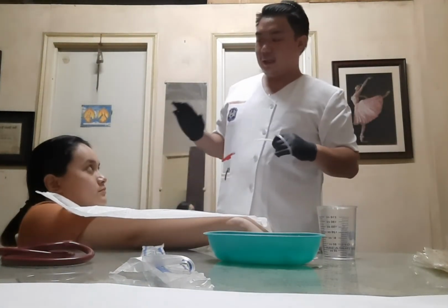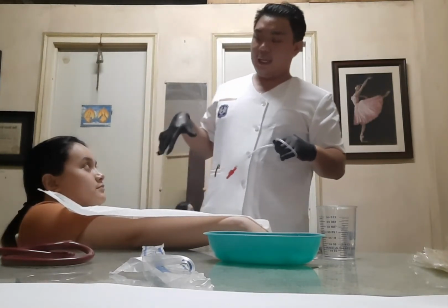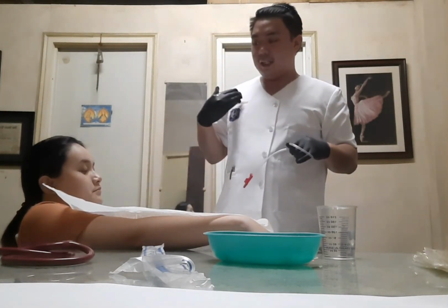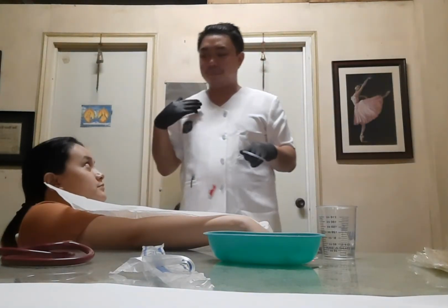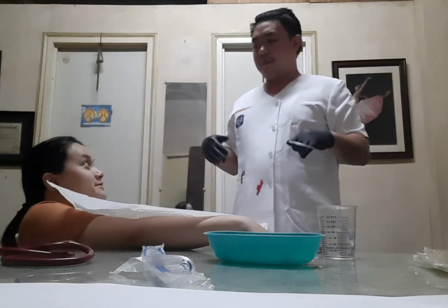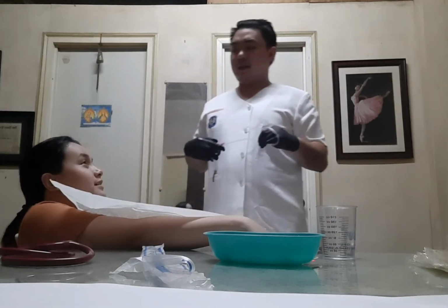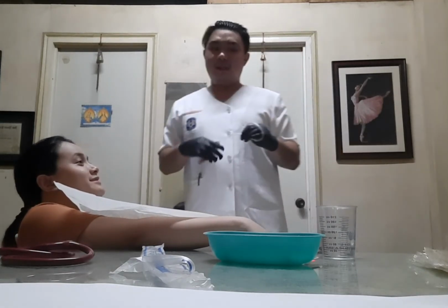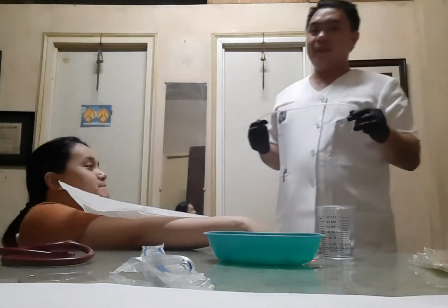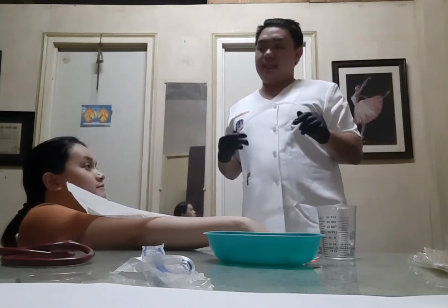And look at the patient and ask the patient if it's okay. Ma'am, do you have any wheezes or crackling or anything that you might feel in your larynx or the pharynx? Yes. A little bit uncomfortable. So the patient still feels there is something that we need to suction one last time.